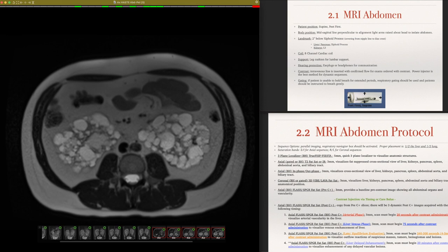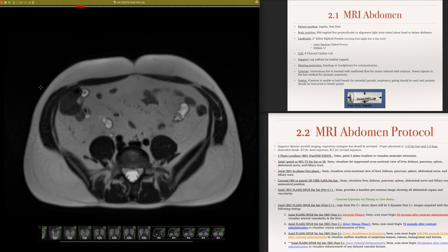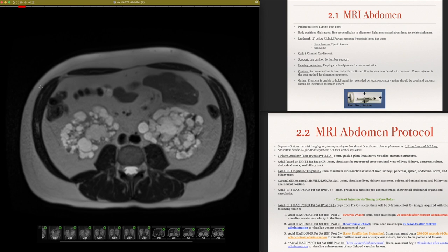Okay. Again, just a very general overview of the abdomen for any MRI techs out there, a little general abdominal protocol, and just a couple of getting-started points. What do you need to get this procedure done? And like I mentioned in the beginning, whenever your patient is, if you're not covering from a tech perspective, yes, you never want to clip, but in case you do, you always want to ensure that you're covering the area of pathology. So in this case, we ran another axial view past to ensure that we covered those cysts that almost ended up in the pelvis. So ensure that you're always covering those cysts, because you never know what you're going to fall into here. So definitely make sure you're covering.